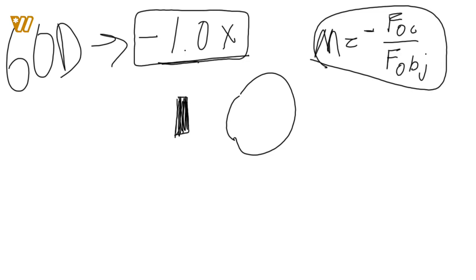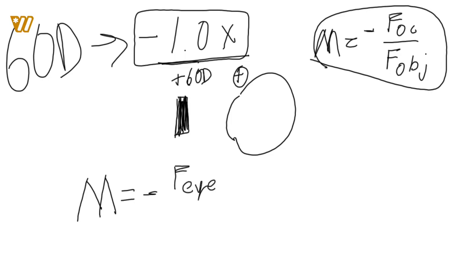All right? So whenever you break this down into the fundus lens and your eye, what ends up happening is you end up creating a kind of reverse telescope, because we've got a plus 60 diopter lens here, and you think of the eye as being a high plus powered lens. We essentially create a Keplerian type of telescope. And so what that breaks down to is magnification equals negative the power of the eye, because that essentially becomes your ocular, over the power of our fundus lens, and that essentially becomes your objective. So we get pretty much a Keplerian type telescope.